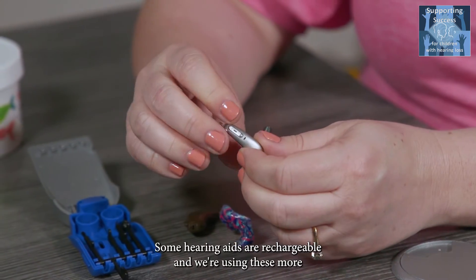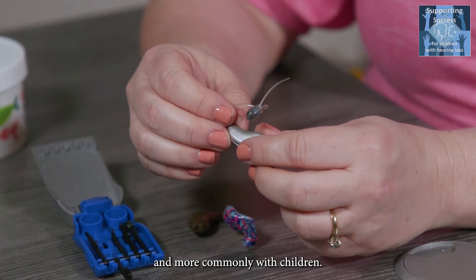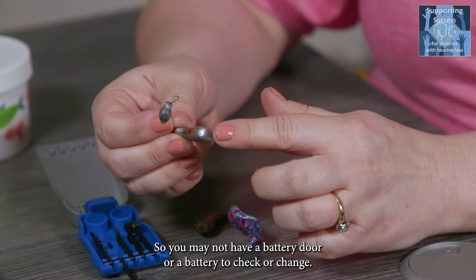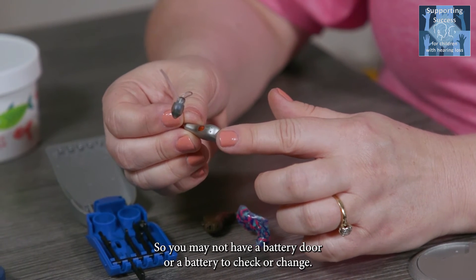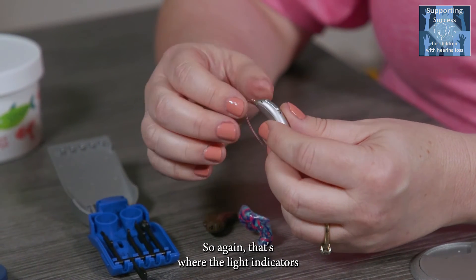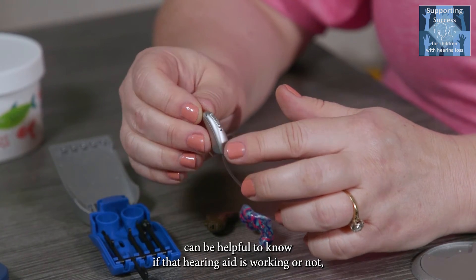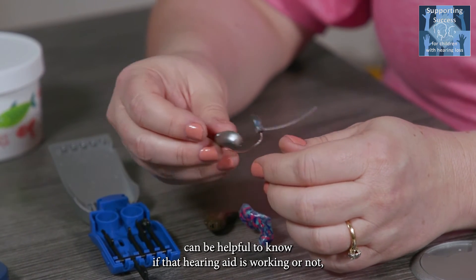Some hearing aids are rechargeable, and these are being used more and more commonly with children, so you may not have a battery door or a battery to check or change. That's where the light indicators can be particularly helpful to know if the hearing aid is working or not.